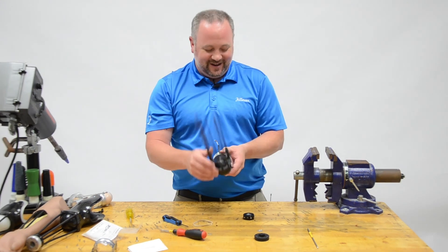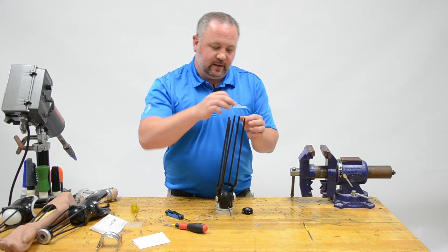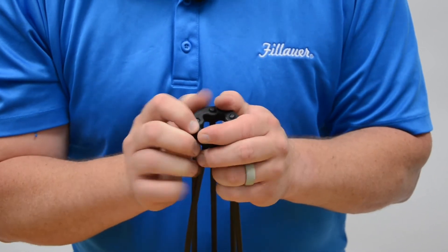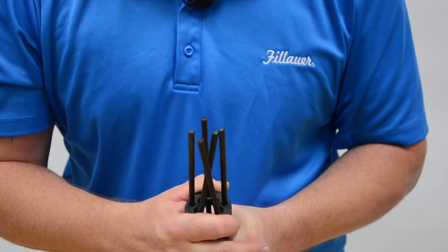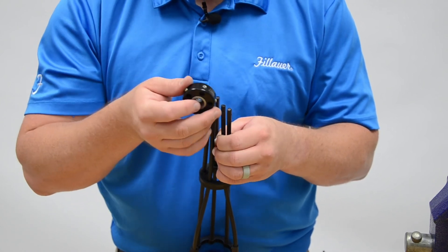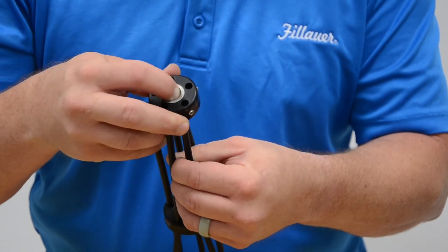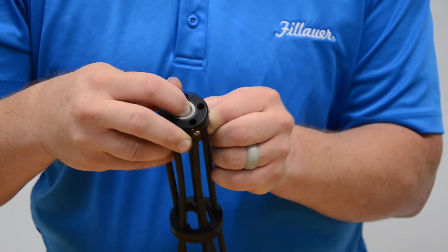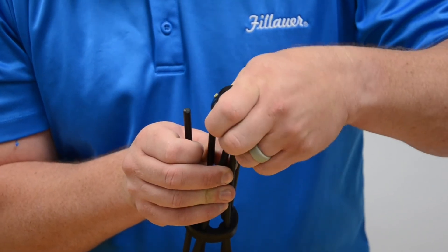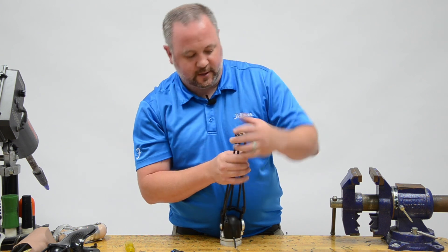The next thing to put in line is the damping ring — place it so that all the rods go through individual holes. Then do the same thing with the wrist unit. Move the damping ring down pretty far to make it easier to place the wrist unit. Take the wrist unit with the large part towards the outside and the flat towards the top, or the anterior of the arm. Get them all stable, placed at the entrance, and slide right on.